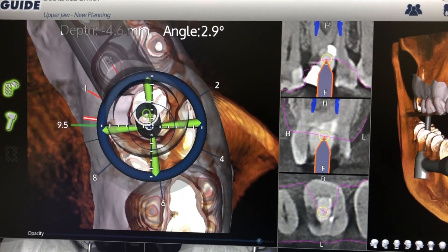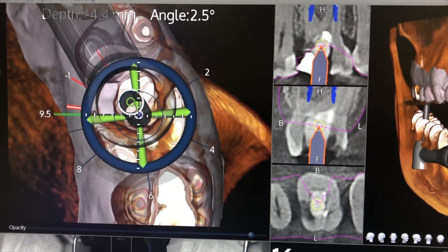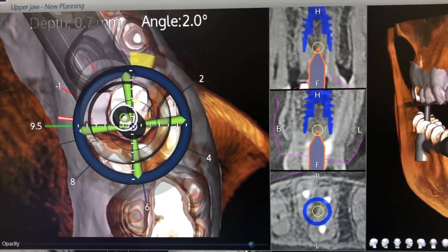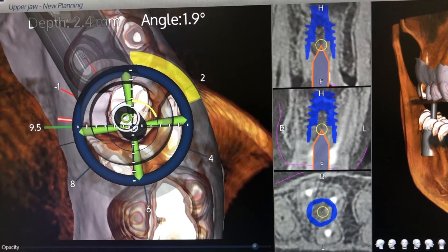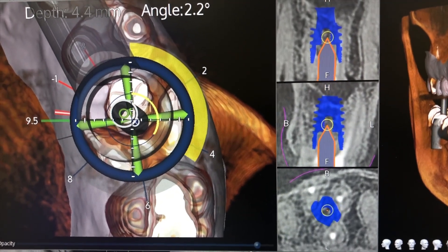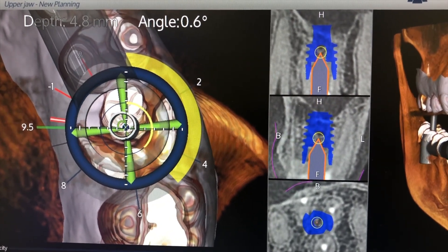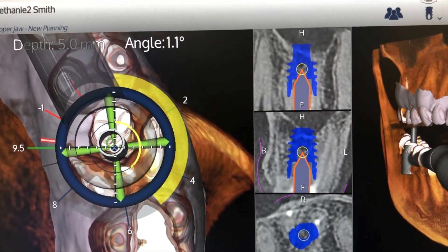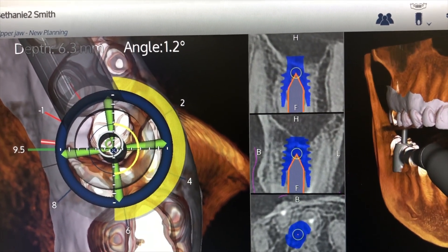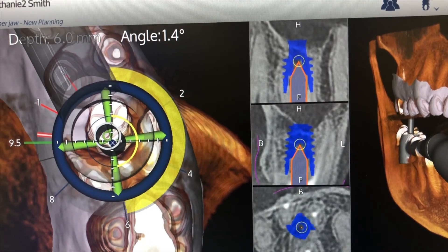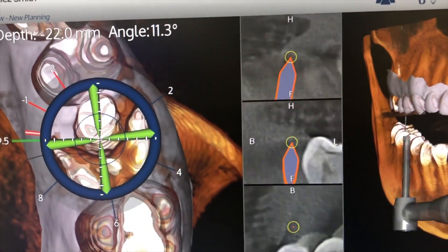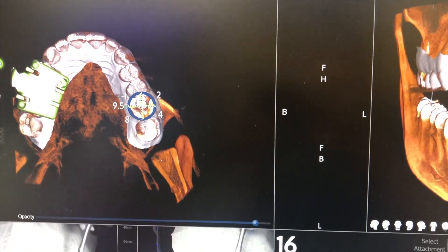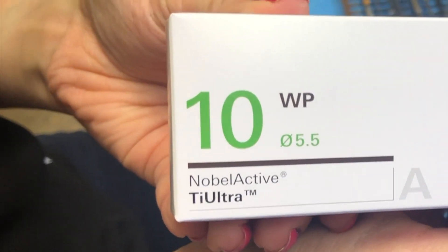You're really navigated here — it's a double navigation occurring. It's right on target again. We're getting down to about five to six millimeters depth, and the angle is about one degree. We're starting to come up, and we'll let the implant do a little work here because we want it to grab and provide stability in that bone.